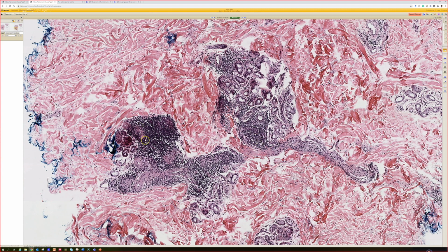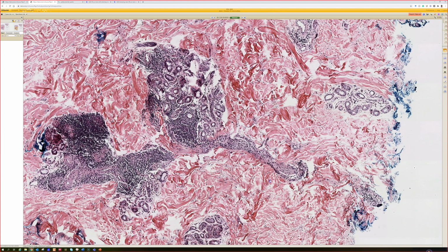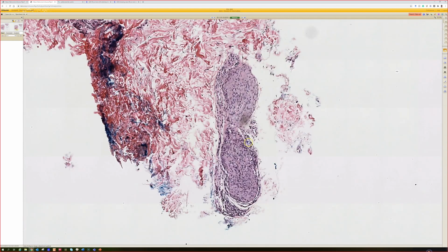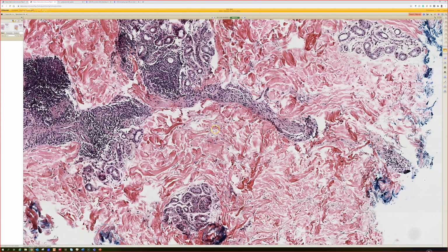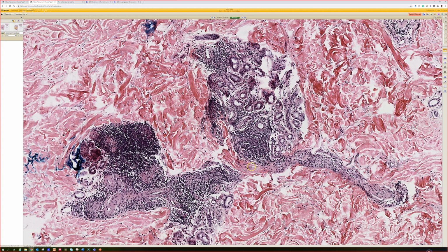I mean, whenever I think perineural, obviously in the section we're in, I would think of leprosy, but that would be more histiocytic. So with the lymphocytes, then I'm kind of in my superficial and deep differential, and that could include lupus. It could include Lyme, which would be infectious. Also, I guess you would consider syphilis because it's a great mimicker.